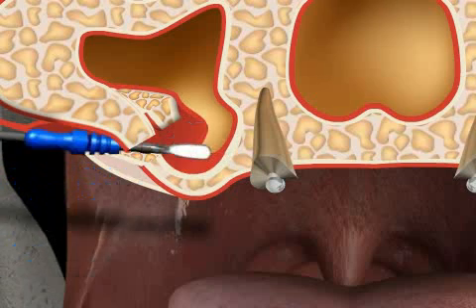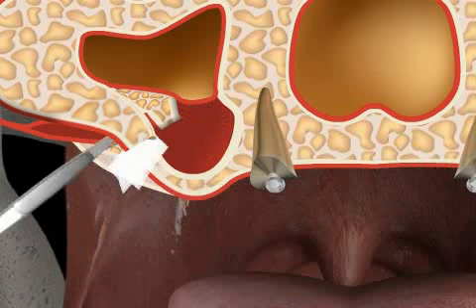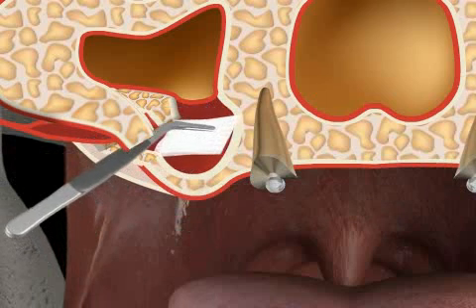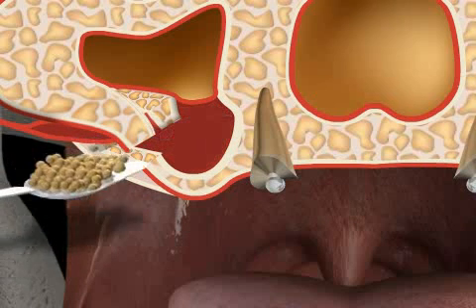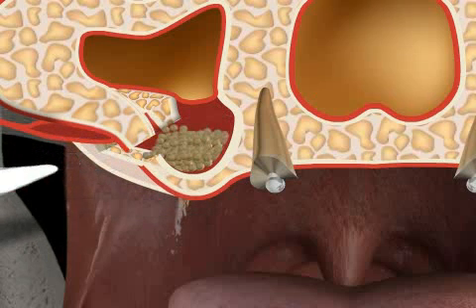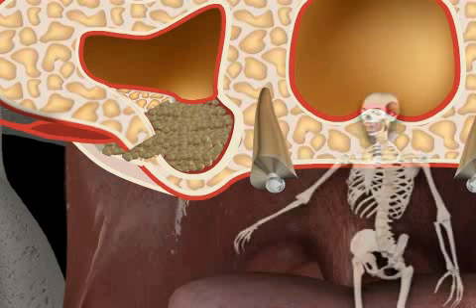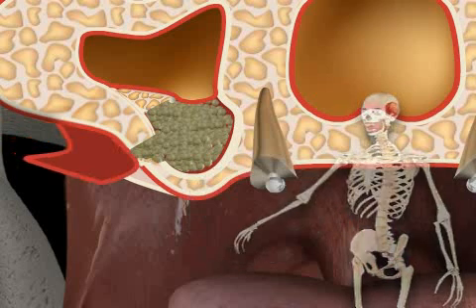One can clearly observe the lifting and lowering of the mucous membrane of the maxillary sinus in the bone window. This is synchronous with the breathing and is a sign that the maxillary sinus's mucous membrane is intact. You can see how a white collagen membrane is inserted into the maxillary sinus to protect the mucous membrane before the bone substitute material is injected. The bone material is then carefully pushed into the newly created cavity as gentle pressure is applied. In other cases, a reconditioning of the bone substitute material with autologous body cells or growth factors might be necessary, but not here.